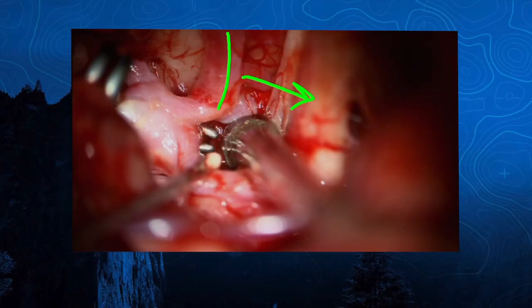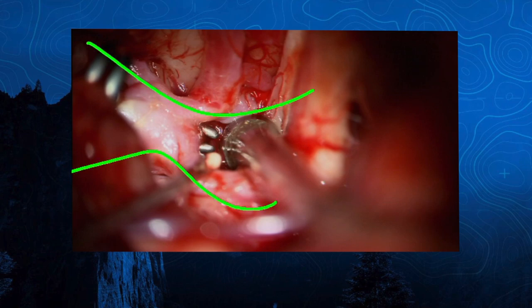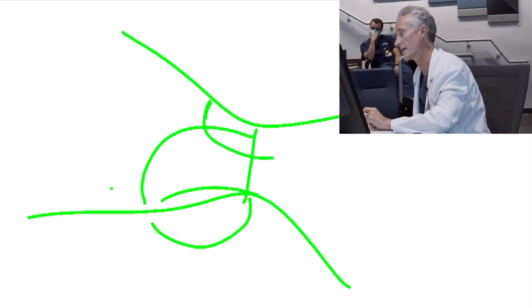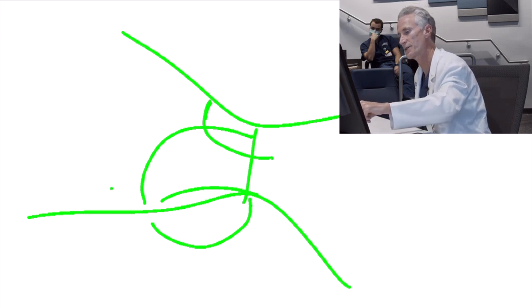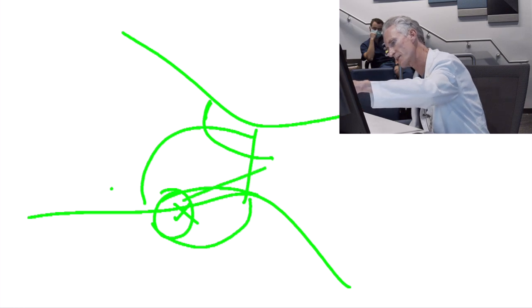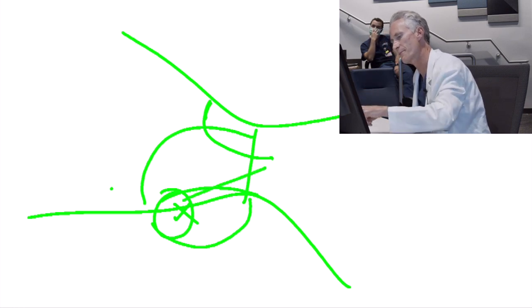Your normal anatomy is basically A1 to A2, and A1 to A2 here, and ACOM there. So this is an extra trunk with the recurrent artery coming off of it. So that aneurysm was kind of like that — the right-angle clip getting across the neck like that on the backside. The fenestrated clip wouldn't have worked. The origin of the A2 is up here, and you'd have to fenestrate the origin here and then somehow get the clip going down, but it'd still be tough to get that portion of the aneurysm.